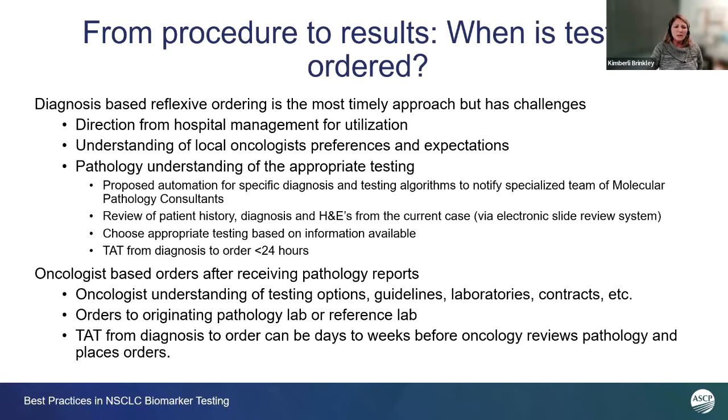There's a process in the workflow where the pathologists that are looking at the tissue for the testing downstream have to review the H&Es. So we're trying to, like I said, automate all those processes so that initial diagnosis to order of these reflexive tests for this non-small cell lung cancer could happen within 24 hours. That's our very best case scenario, and hopefully we'll get more people to adopt that kind of workflow.